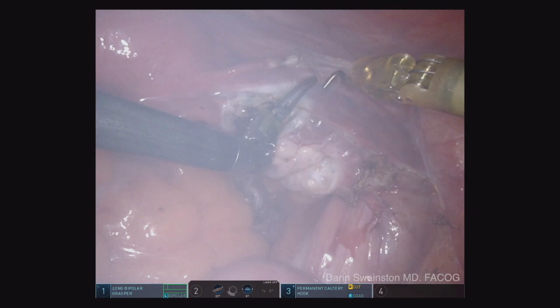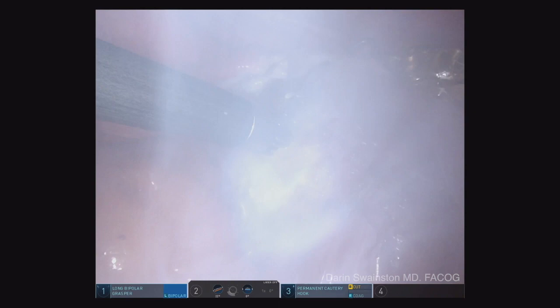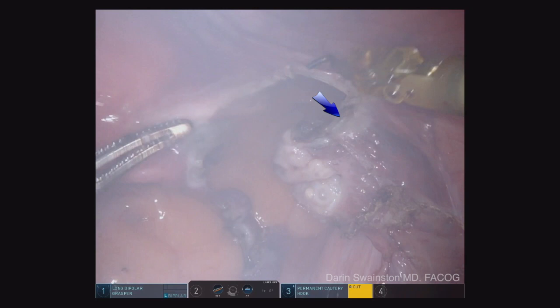What you want to leave behind is the least amount of char as possible. I do that with a one-third/two-third technique: I leave behind one-third of the thermal artifact, and the rest of the charred tissue is part of the uterus being removed. That way you limit the amount of thermal artifact left behind, which I think translates into less pain for the patient.